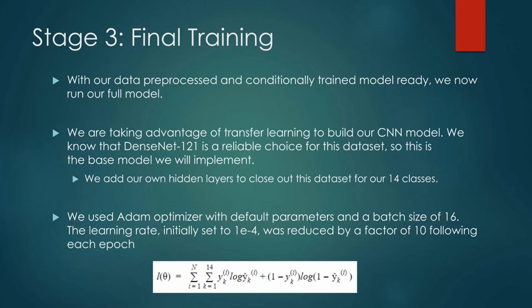This is the same implementation that we learned from the current leaders of the CheXpert competition, and they have confirmed that DenseNet is the best working transfer learning for this dataset, so we're using their implementation in these regards.